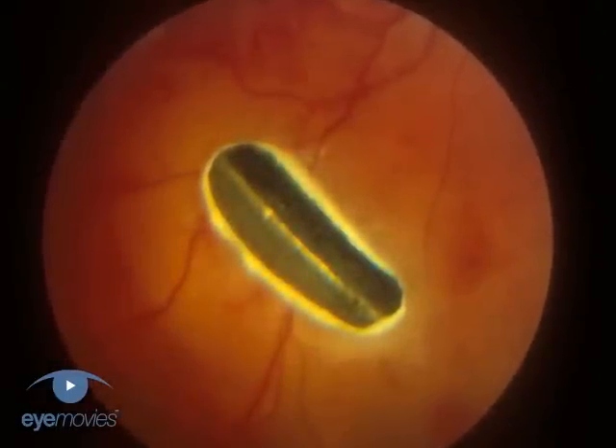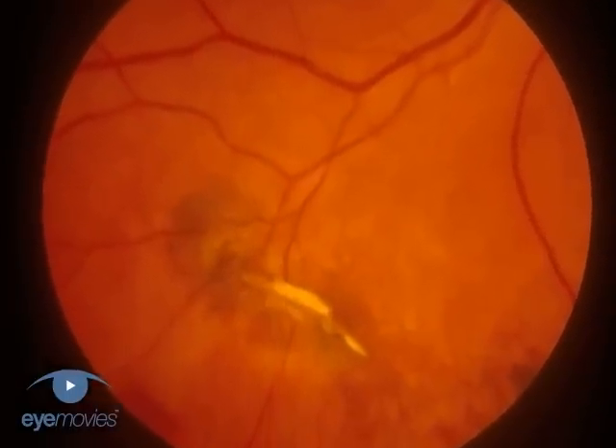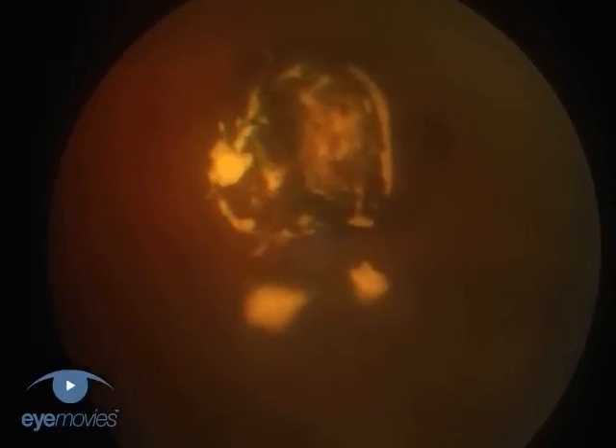The removal of metallic intraocular foreign bodies presents a wide range of challenges to the vitreoretinal surgeon. In most cases, injury is the result of high-velocity particles arising from metal-on-metal contact, such as a hammer hitting a chisel.